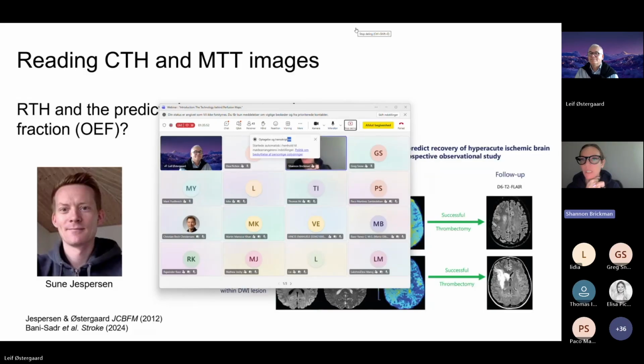It was truly a pleasure to see. Regarding the parameters that are being estimated, a lot are based on CBF. However, quantitative CBF depends on the accuracy of AIF determination, which suffers from various effects, including signal saturation, partial volume effects, vessel selection, etc. If quantitative CBF is suffering from that many biases, how does this relate to CTH, OEF, and CMRO2, as these are based on CBF?